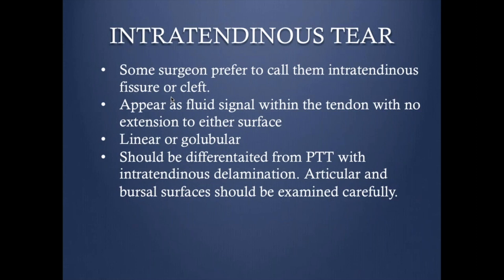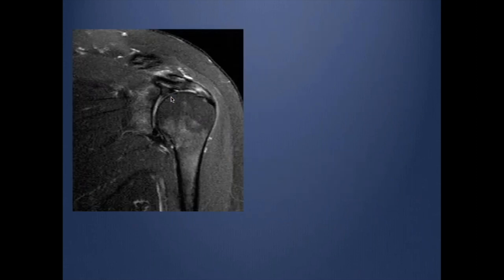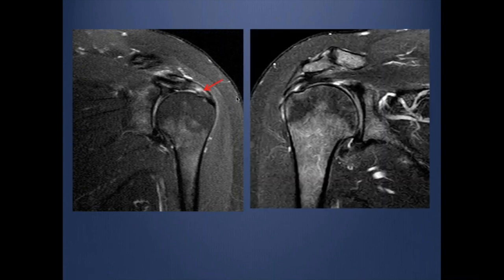You have to be careful — scroll very carefully in your sagittal and coronal images to see if there is any extension to the articular or bursal surface. This is an example where you can see an abnormal fluid signal within the tendon with the articular fibers and bursal fibers intact — an example of an intrasubstance tear. Another example shows a linear signal with both bursal and articular fibers intact, also called an intrasubstance tear.